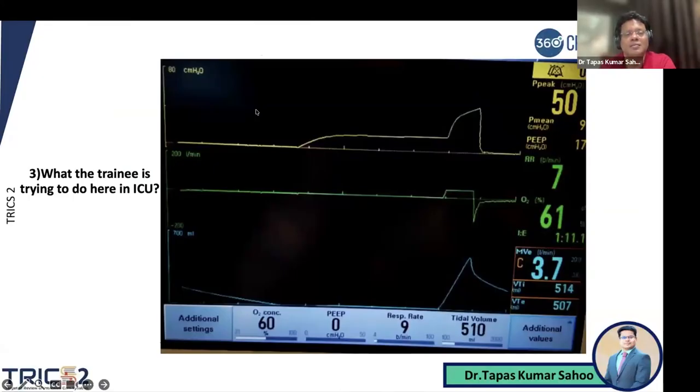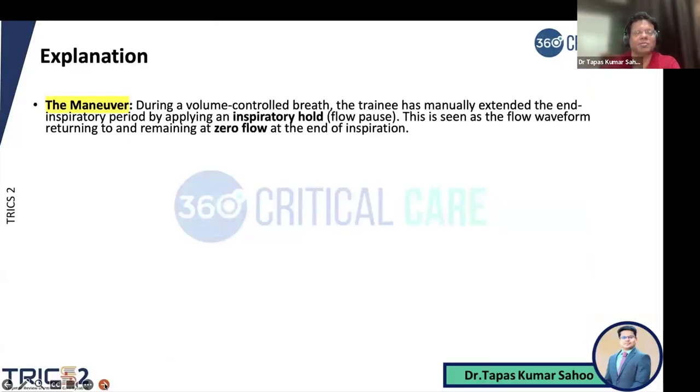Anyone? Are you all with me? What is the trainee right now trying to do? Any answers? Anything? No answers? Okay. So now you have to follow certain principles.